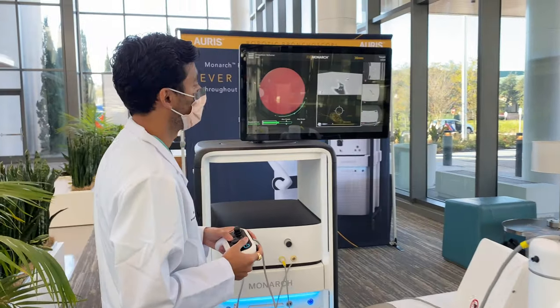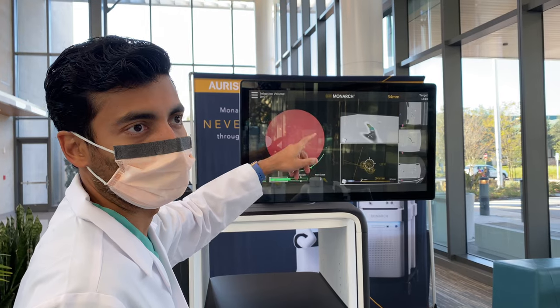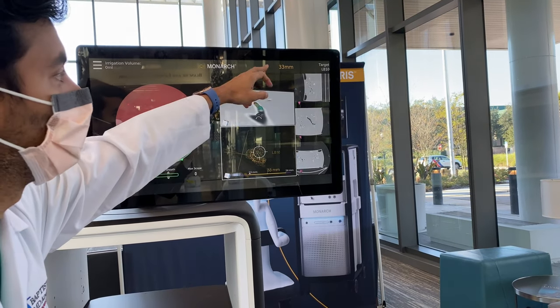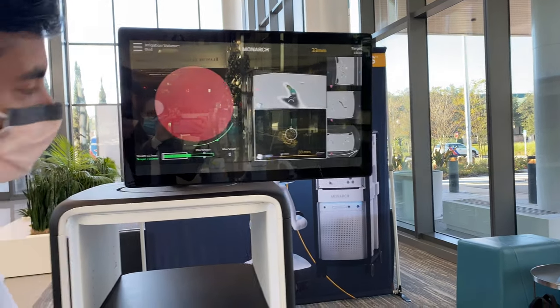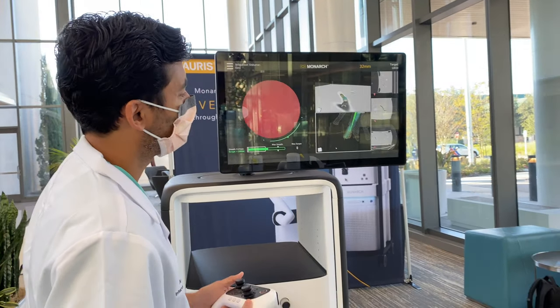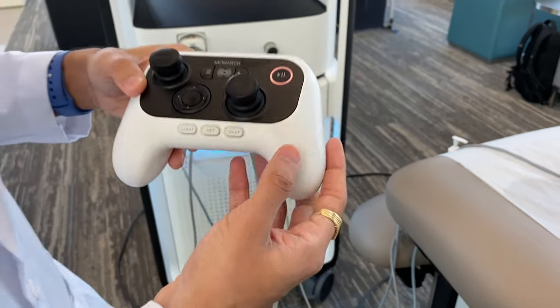Now I would like to share some of the features on the screen. On the left here is the bronchoscopic view that is actually constantly present despite you actually having to biopsy the lesion. The bottom right screen here actually shows you a call-of-duty-style sign, which means how far you are from the target — which is 3.3 centimeters here — while you're actually hitting the center of it. It's confirmed with this green light, so you're right on target for the lesion and can start sending your biopsy tools down. This function on the controller pauses the scope, so now the scope will stay immobile so you can perform a biopsy.